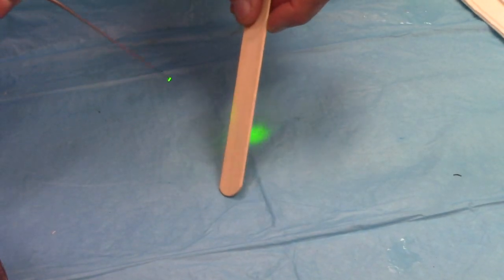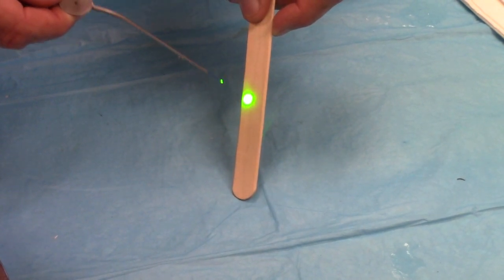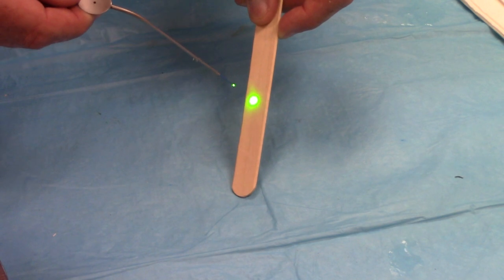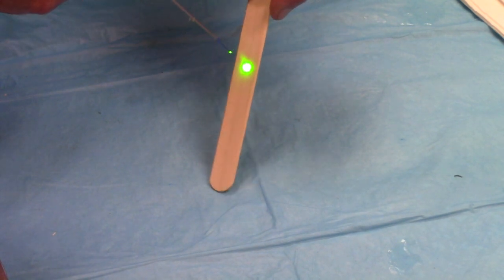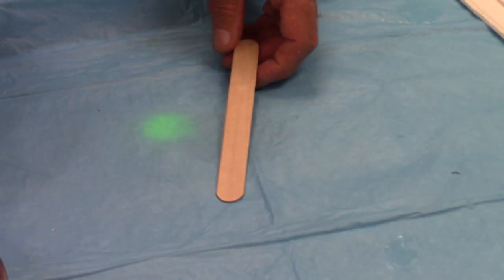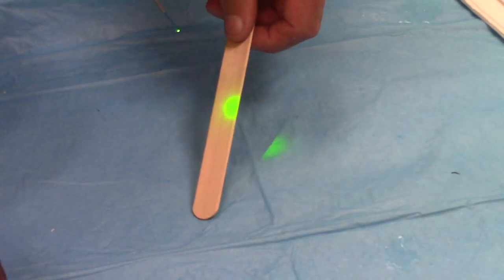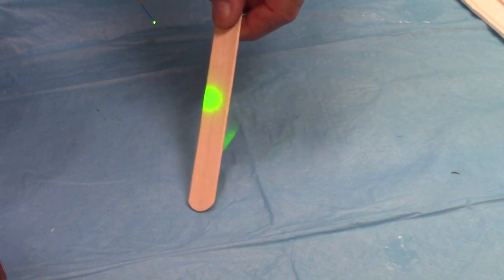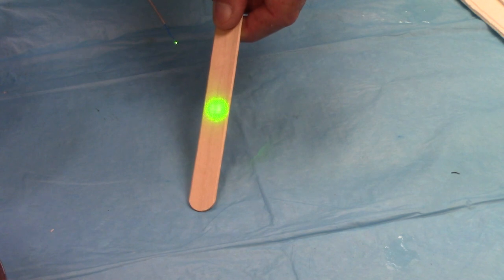This Holmium laser has a green guide light with it. Most have red, but this one happens to be green. Of course, that's not the actual laser — you can't see the 2100 nanometer Holmium YAG. So on a clean tongue blade, let me show you that this is live-firing out here in the air at 1.2 joules. I'll start from far away and you can see the effects as the power density increases because the spot size gets smaller.